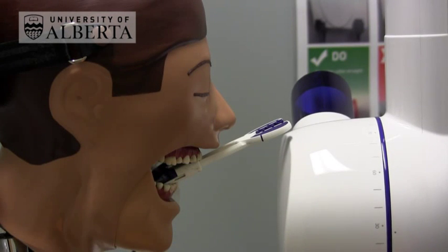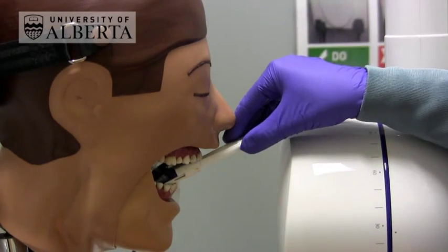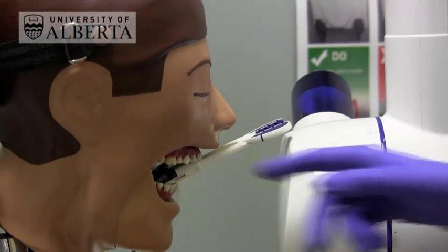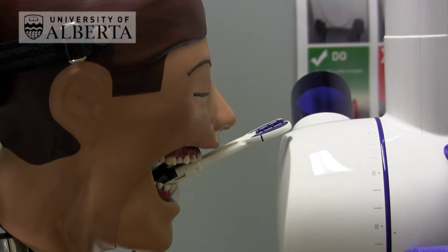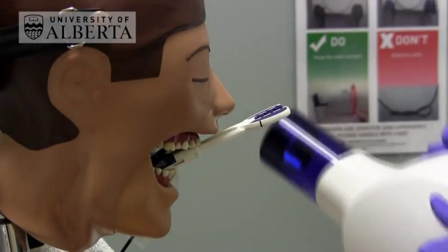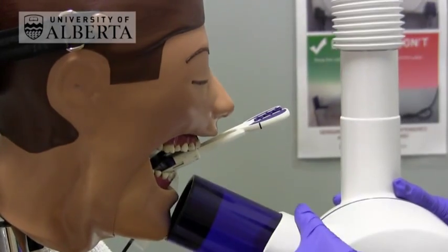For lower anterior periapicals using the bisecting angle technique, position the holder like this and get the patient to bite together onto the bite block. Then use a minus angulation of minus 20 to minus 30 degrees and position under the chin like this.